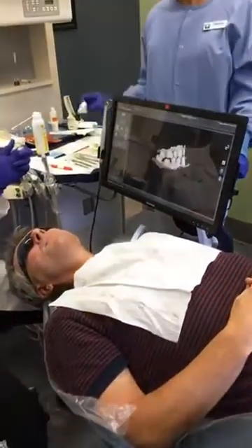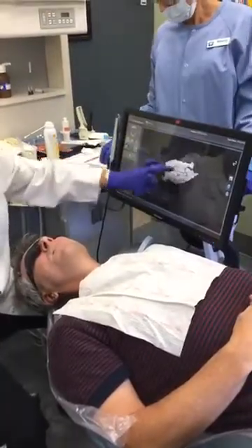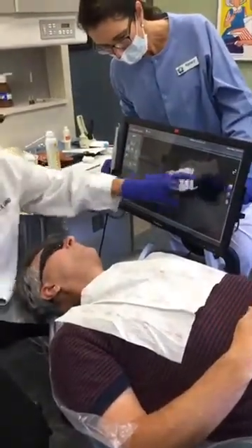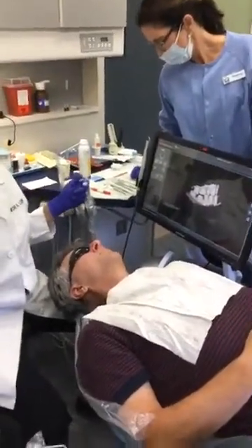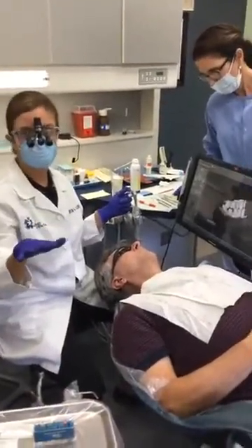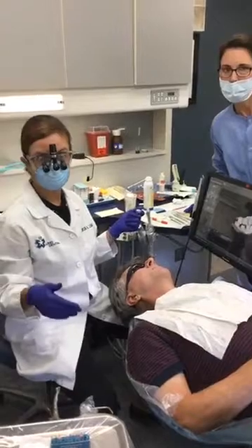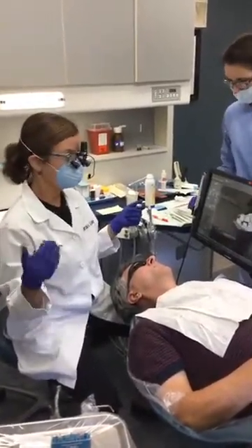Since we're only doing one crown in one part of his mouth, we only need to do what we call a quadrant. We don't need to do the whole bite, but we can look at it from every direction we like — top, bottom, sliding together. When this gets sent to the lab, what does the lab do with this? They actually don't fabricate a model anymore. They take the digital image, import it into their software, design the crown, and then it's instantly milled. On a single tooth, you do not need a model — it cuts down on working time. We still like using the lab because we think they do an exceptional job, and we do the digital color matching.